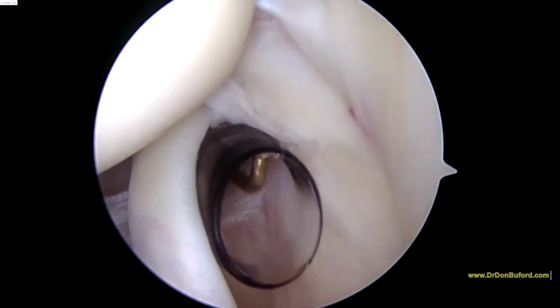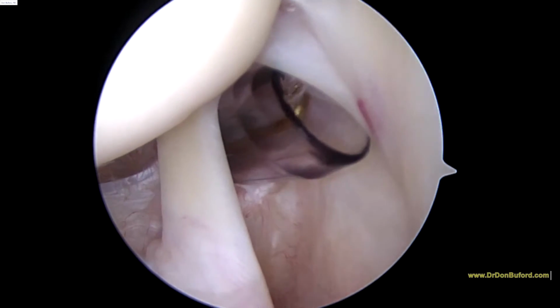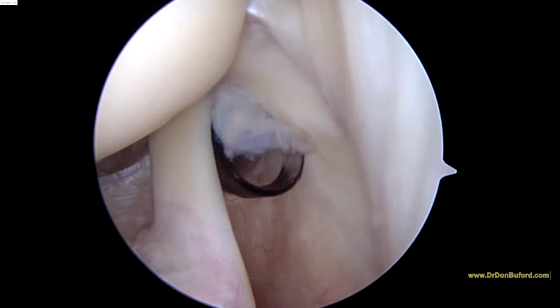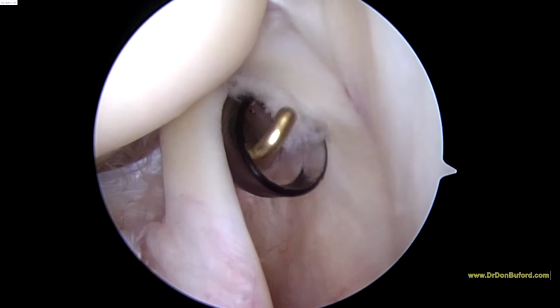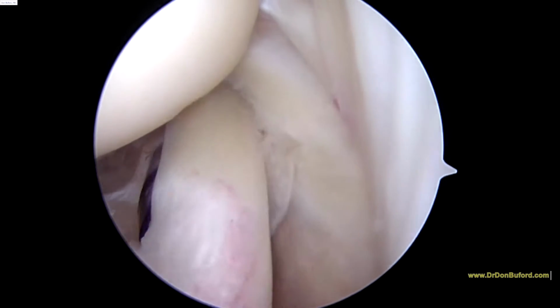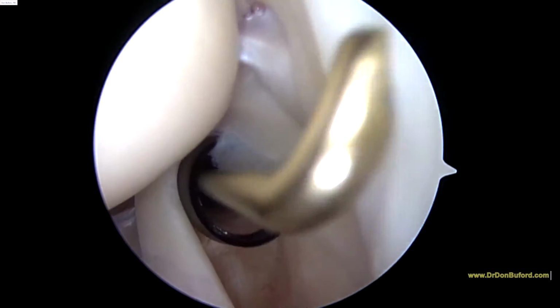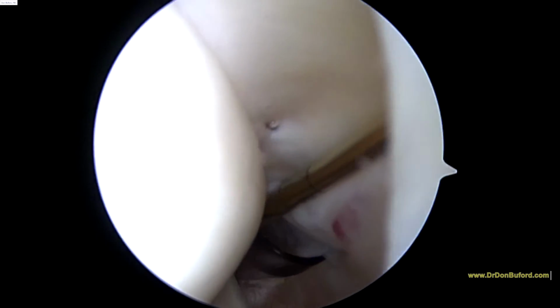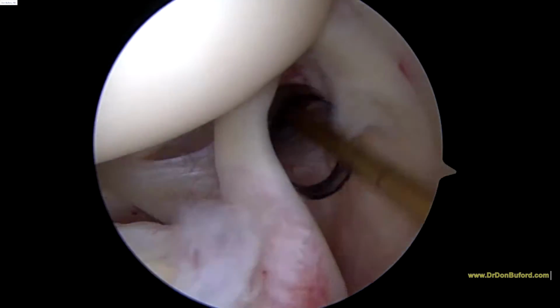A little bit of a fraying of the undersurface of the, really the most anterior edge of the supraspinatus. But that whole area is just 2 millimeters, super small. So we'll debride that, and it should be of no significance, no consequence. Now the rotator cuff on this side looks pretty good as we look up here. Okay? We're going to come around to the back.